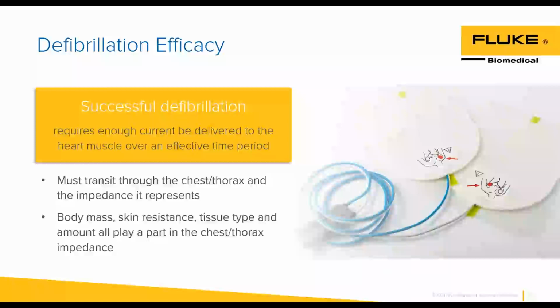Here are some other things we talked about. Remember, not every patient has their heart attack or has their issue in the clinic. These are usually out and about. Are they in a swimming pool? Are they wet? Is it an accident scene? Are there fluids on them like oils? There are a lot of other things that could play into effect here that need to be thought about to make sure that patient is getting that correct value.